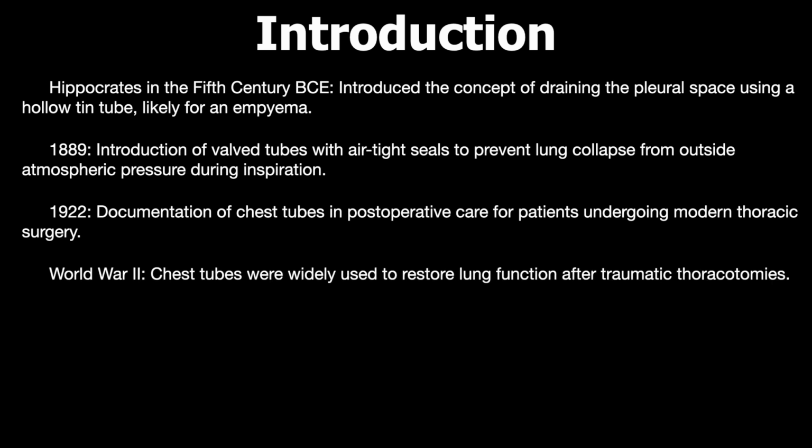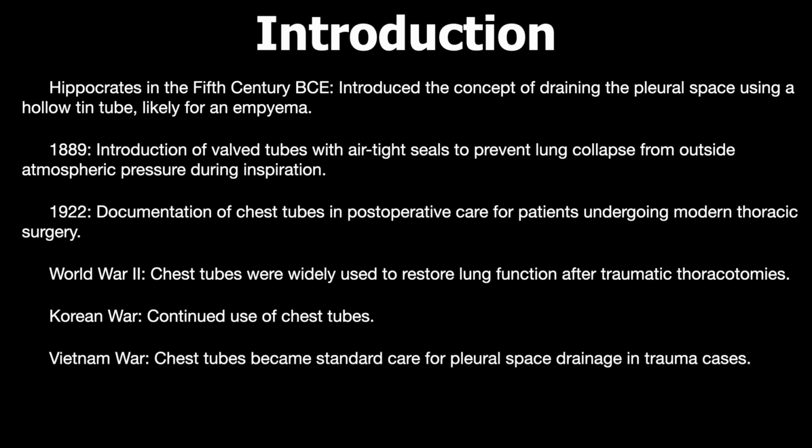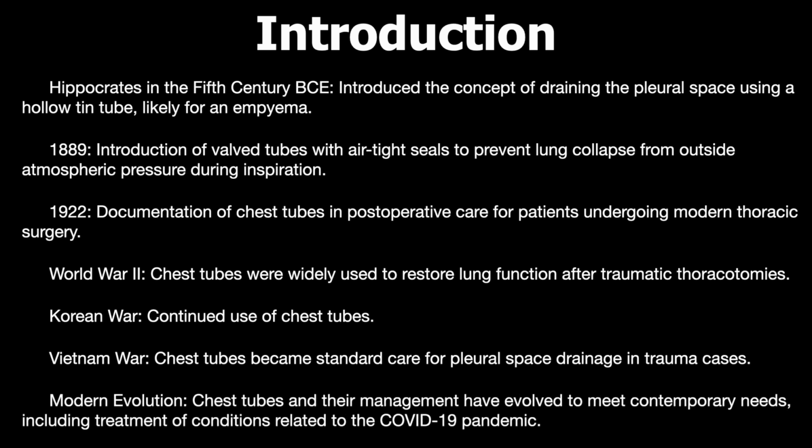In World War II, chest tubes were widely used to restore lung function after traumatic thoracotomies. In the Korean War, there was continued use of chest tubes, which remained the standard of care during the Vietnam War as well. Now, in the modern evolution, chest tubes and their management have evolved to meet contemporary needs, including treatment of conditions related to the COVID-19 pandemic, which saw a lot of ICD insertions.